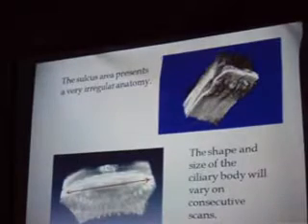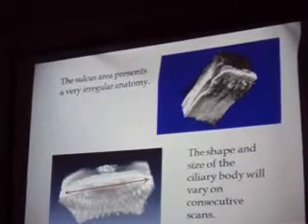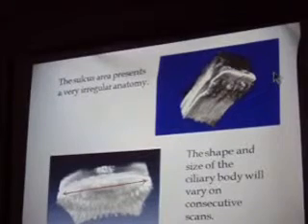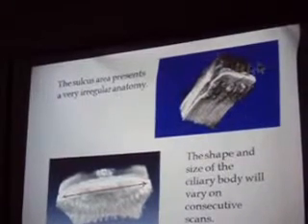These are two 3-dimensional images of the sulcus area, the ciliary body. The one on top was done by Goodhoff many years ago with the old UBM, the Humphrey UBM, Paradigm UBM.